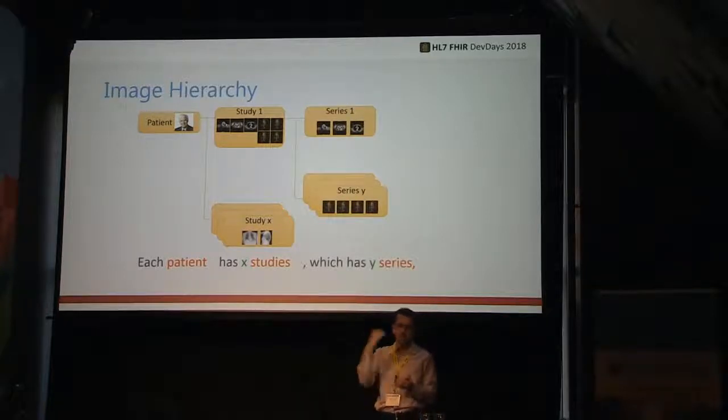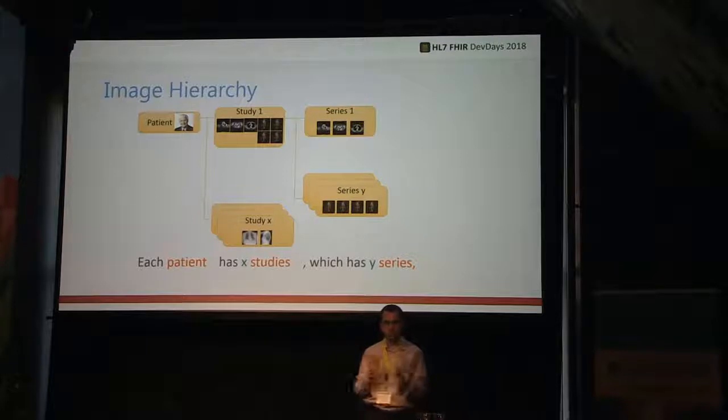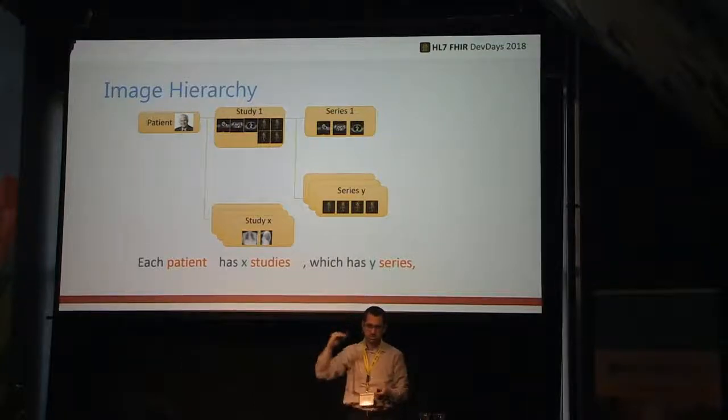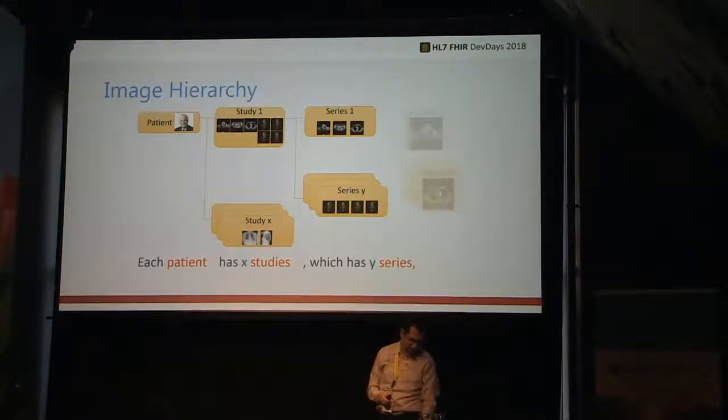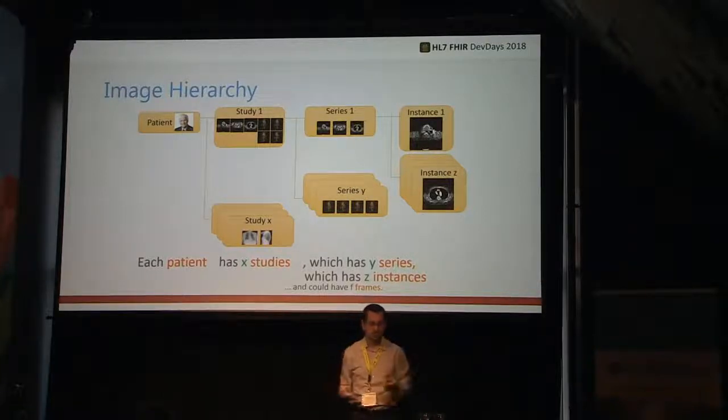Within the study, you have a series. So a series may be, sometimes you may need a procedure where it's multiple modalities. They maybe need to do a little bit of an X-ray along with the CT. So these are series within the study. And then within the series, you have the instances, which are the actual images.